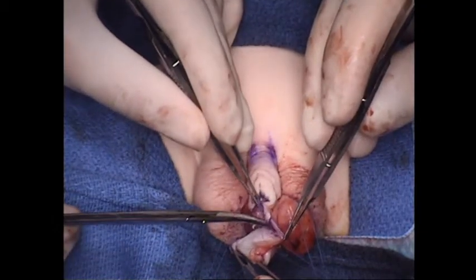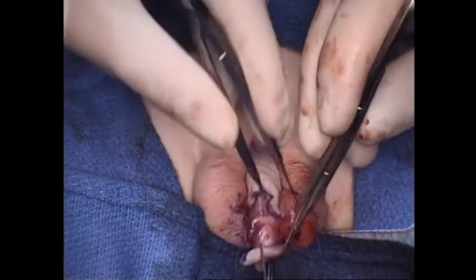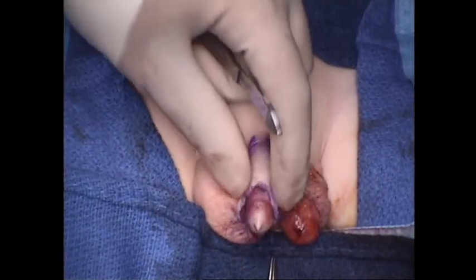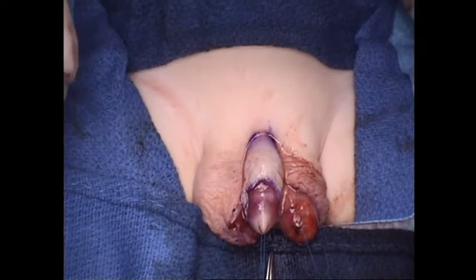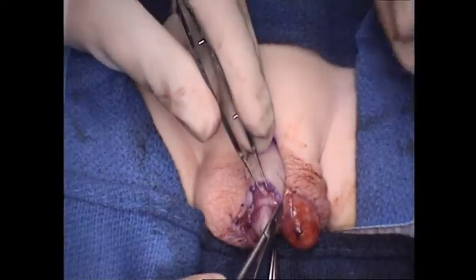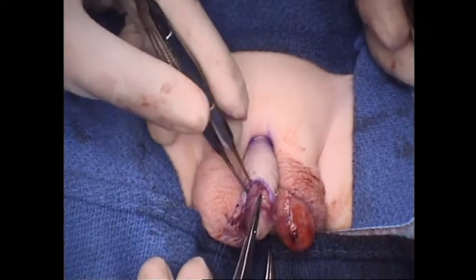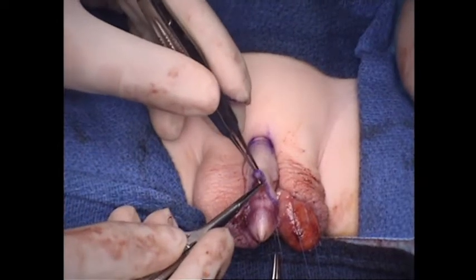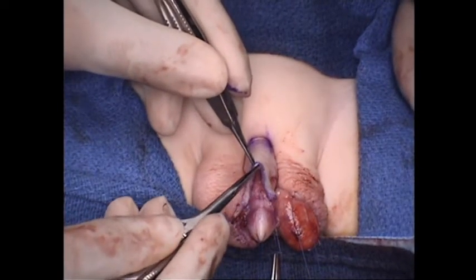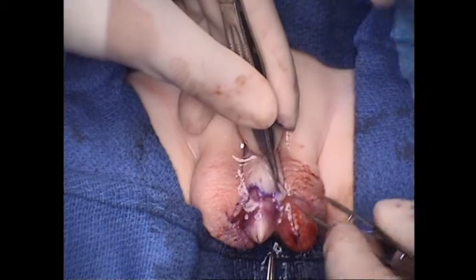I'm going to come up to this corner here, and then we will take that off right there. Again, the principle is to cover the penile shaft, and then everything left over is graft. If you do it that way, then there should be enough for both. If you happen to mess up, you've always got a backup plan of going to oral for your urethroplasty, for your urethral graft. But you shouldn't have to do that in the vast majority of cases, and we haven't had to do it, but at least you've got a plan in place.